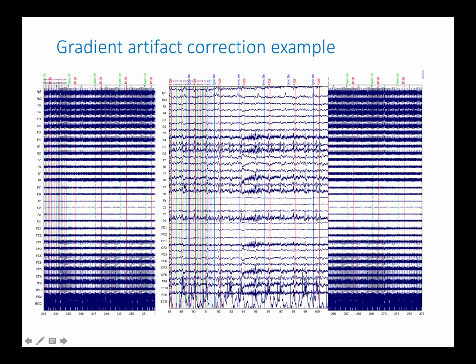So it's a lot less noisy, and you're removing all of the imaging gradient artifact, which is basically drowning out all of these more subtle effects. And down here you can actually see the cardiac signal trace. It's sort of on top of one another, but hopefully you can see that.